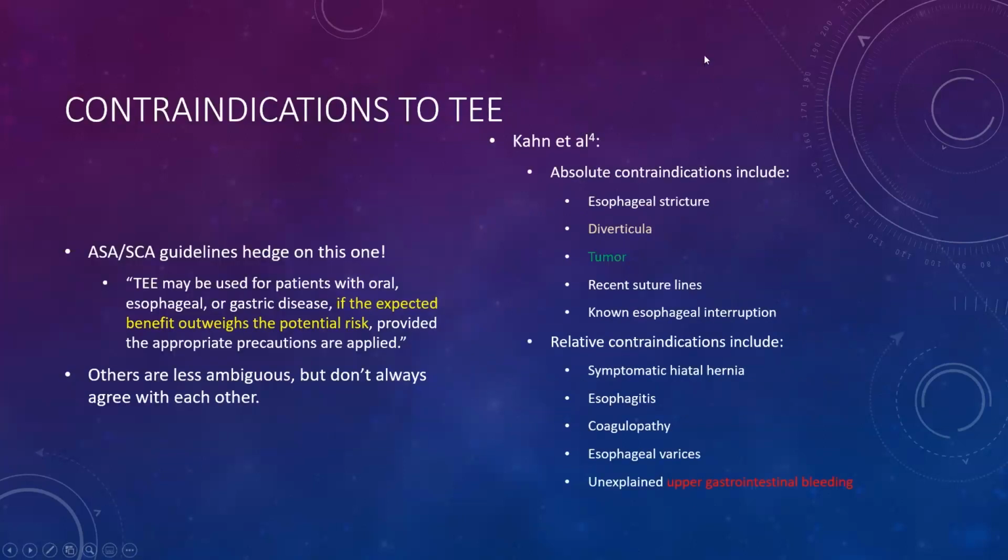So it's a great modality, but there are definitely contraindications. One thing that I do want to point out is that there's a little bit of discrepancy depending on who you're asking what the absolute and relative contraindications are. So again, ASA, SCA, they hedge a little bit on what the contraindications are for TEE. And they ultimately say if expected benefit outweighs the potential risk, go ahead.